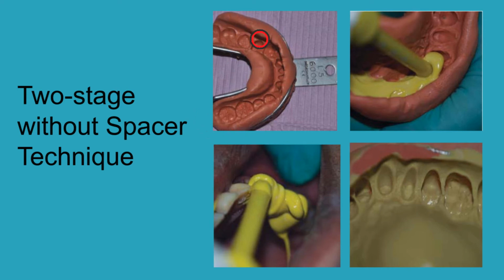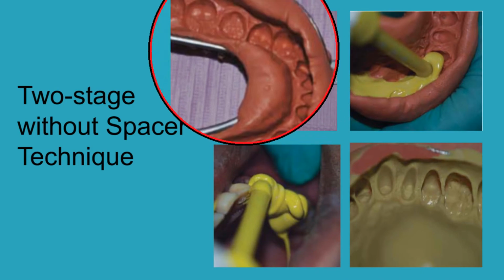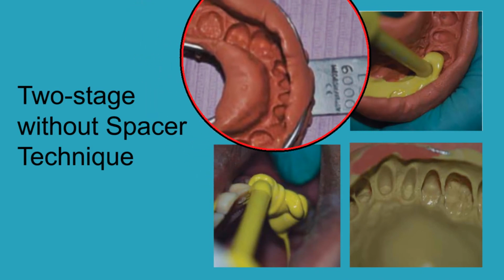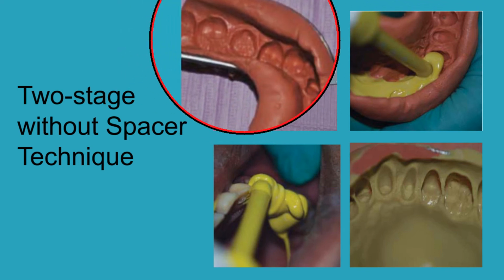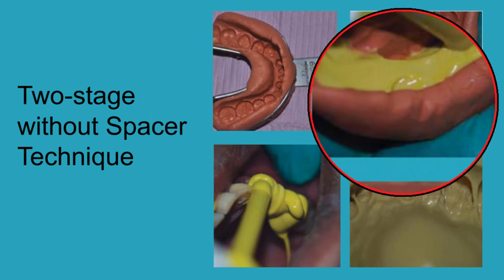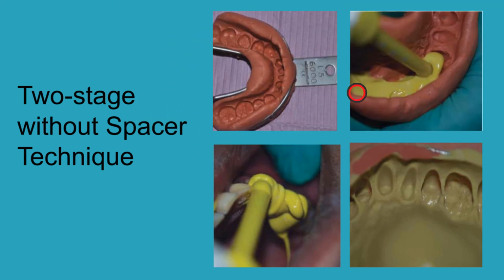And then you pick this up, okay. You pick this impression up, you cut down all the interdental areas with a small BP blade, okay, so that we get space for a light body. Then you inject the light body, right, also in the patient's mouth without lifting the nozzle because we have to avoid air incorporation, and then we make the impression.